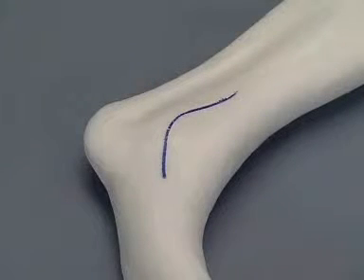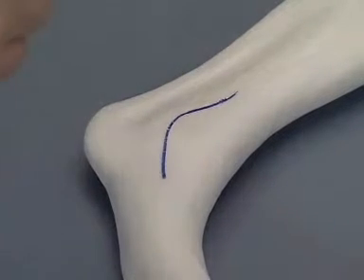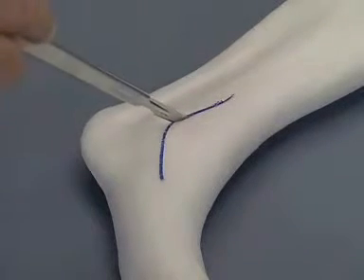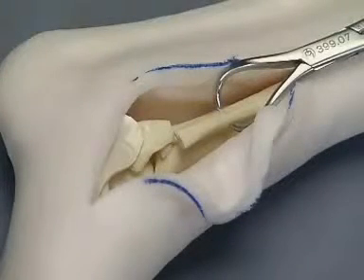The landmarks for the incision for the lateral malleolar fracture are the fibular malleolus and the base of the fifth metatarsal bone. The foam is incised over the lateral aspect of the fibula and the tarsus, and retracted to expose the fracture.